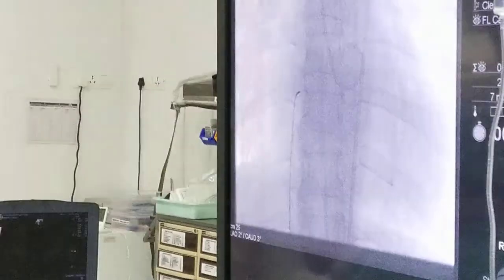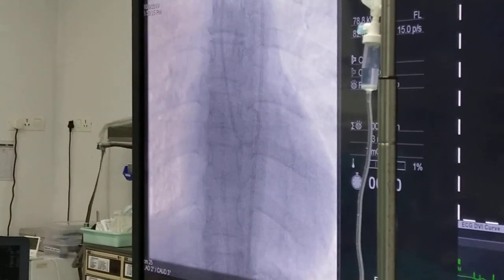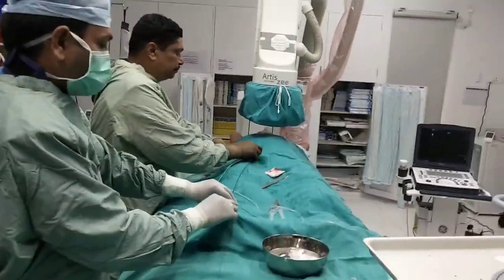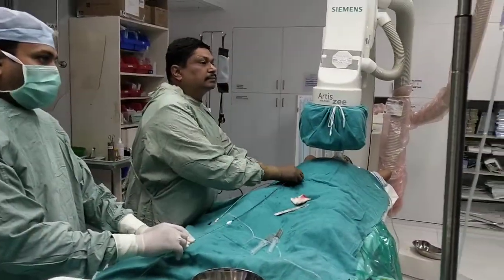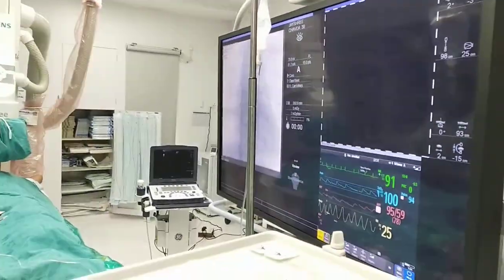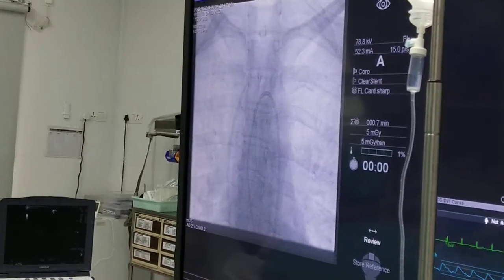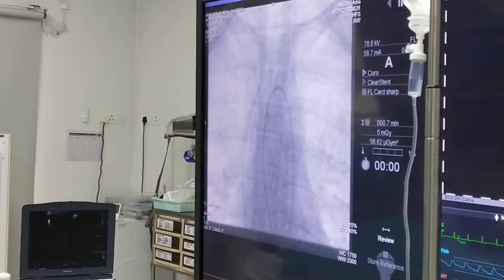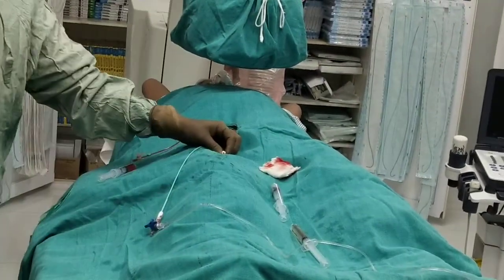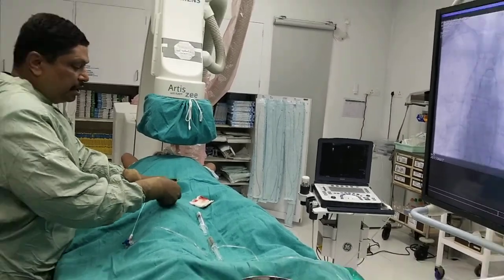Now we will put a Mullins wire into the SVC because we have to access the SVC and advance the Mullins sheath into the SVC. We have to make it air-free and bubble-free and keep it wet. Through this Mullins sheath, we will then pass a transseptal needle.